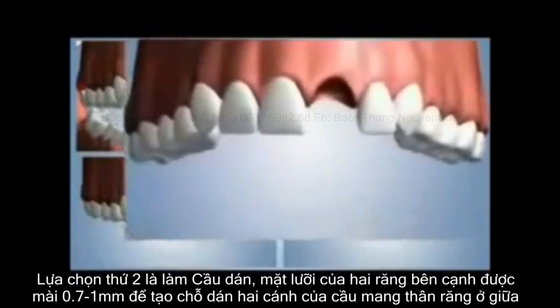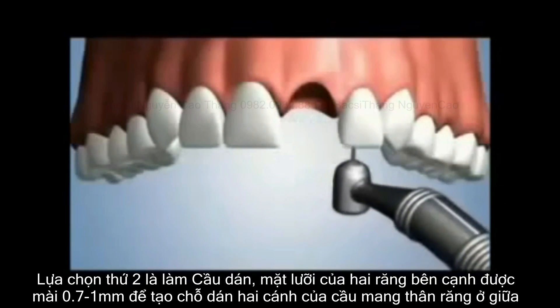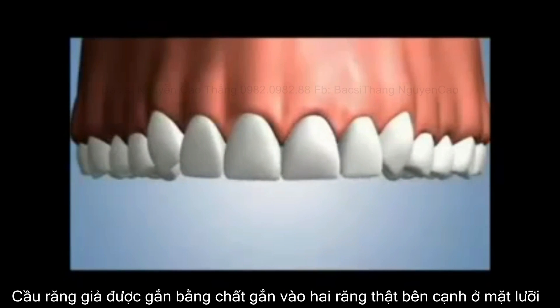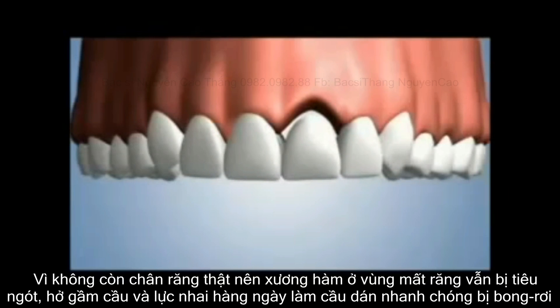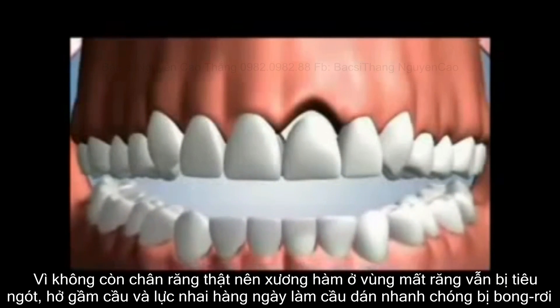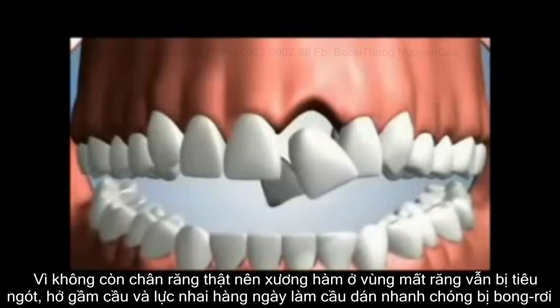In a second option known as a resin bonded bridge, a high speed drill is used to cut into the back of the neighboring teeth. A prosthesis is then added to the back of your natural teeth. With the absence of the natural tooth root, the bone above the crown begins to shrink. Every day biting forces will also begin to apply opposing pressures that will loosen the bond over time.